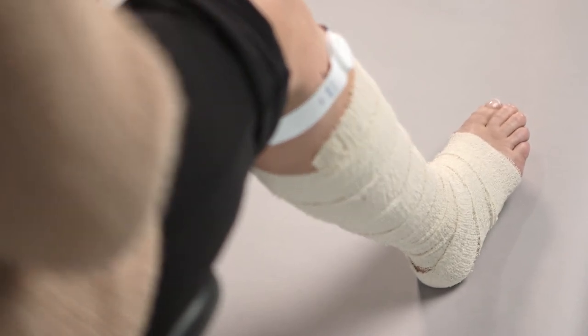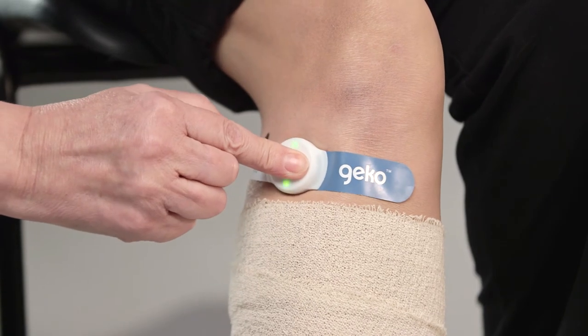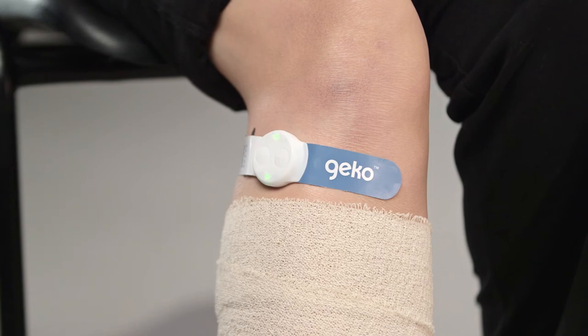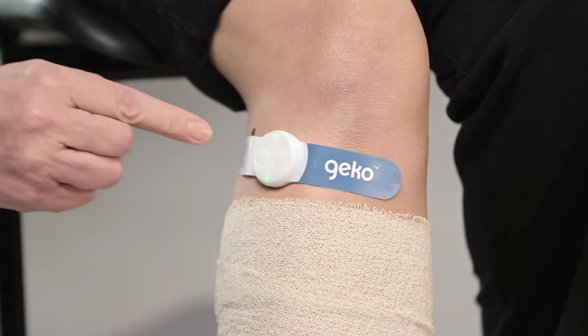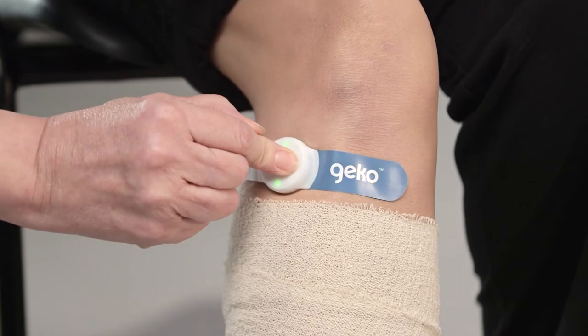The common peroneal nerve is closer to the fibular head in the sitting position. There are 10 stimulation levels in the Gecko wound therapy device. The settings are indicated by the number of flashes in sequence from the LED lights while the device is in operation. The setting may have to be increased if the patient is standing or lying down, and reduced when sitting.